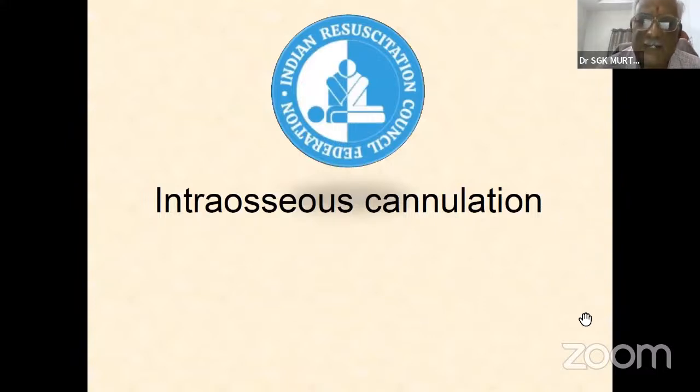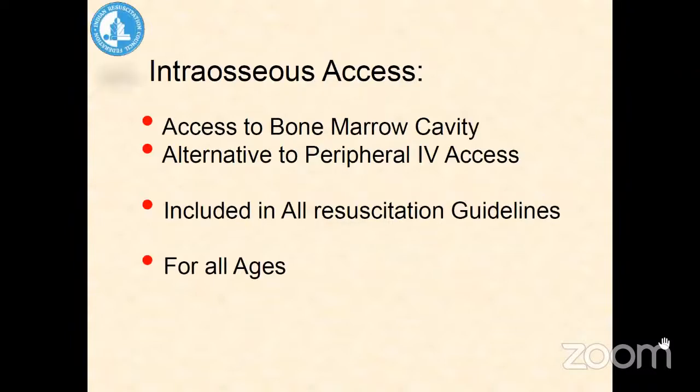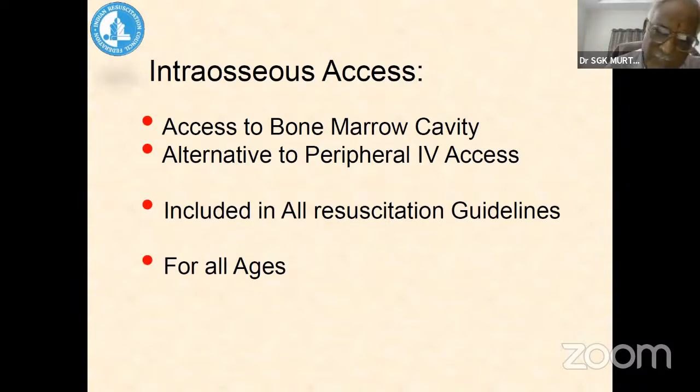The intraosseous cannulation is always a second choice. Whenever IV cannulation is not possible, then only we have to think of intraosseous cannulation in case of emergencies. This is access directly to the bone marrow cavity, and it is an alternative to peripheral IV access for drug as well as fluid administration, including resuscitation.